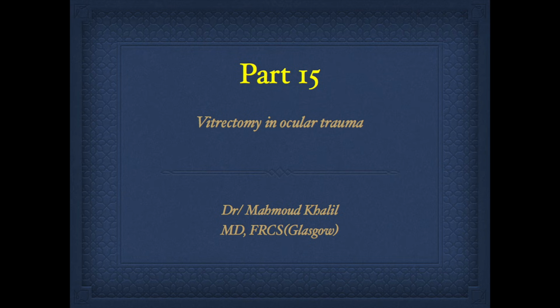Welcome back. This is part 15 of step-by-step vitrectomy: vitrectomy in ocular trauma.